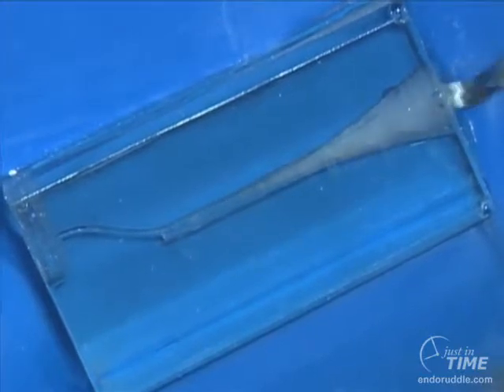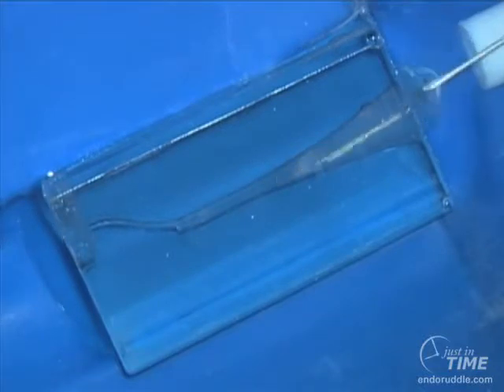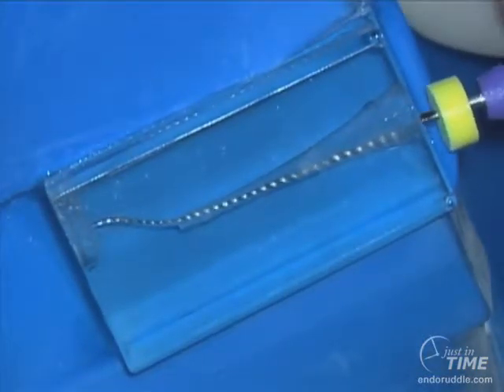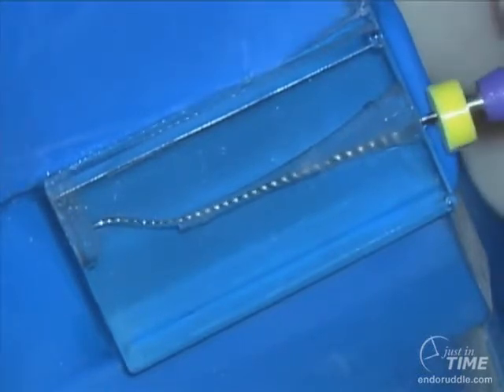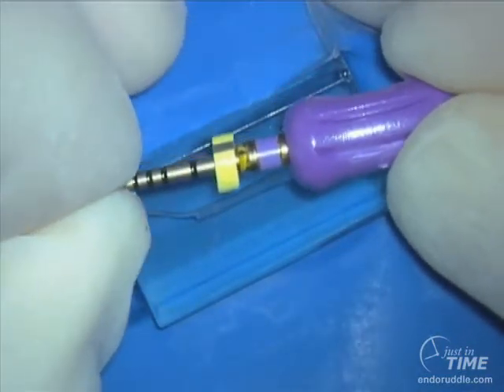If you need more shape, simply use a rotary shaping file coronal to the ledge to give you a little bit more working width. Sometimes a greater working width allows you to take a pre-curved file and pass it through a pre-enlarged canal so that when you get to the impediment you can more readily bypass it.